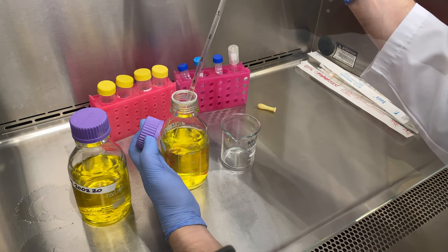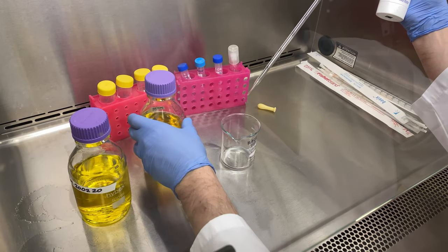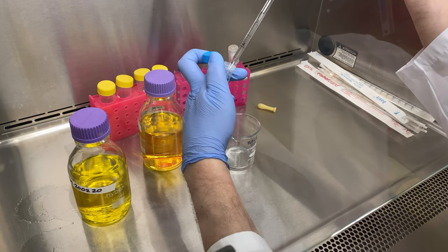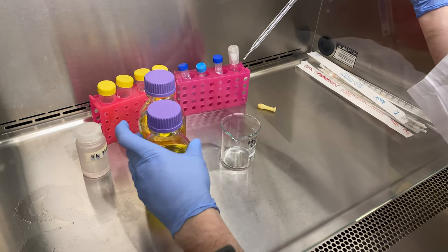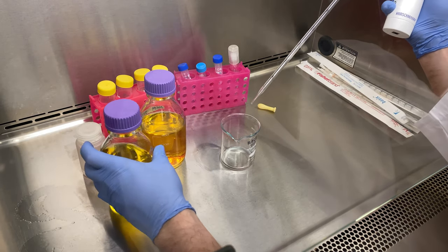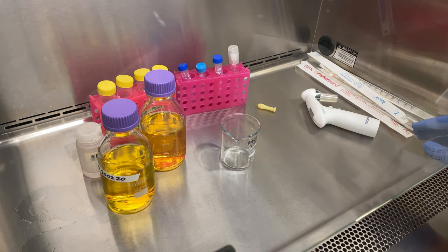Notice what happens when we add it in. There is phenol red inside — a pH indicator. And as we add this, it will change the pH by making it more basic. Initially when you add it, it will turn red. And then as it dissolves, the solution will just become more orange, not so bright yellow. So our sodium bicarbonate has been added.